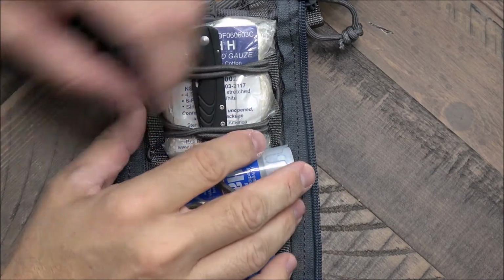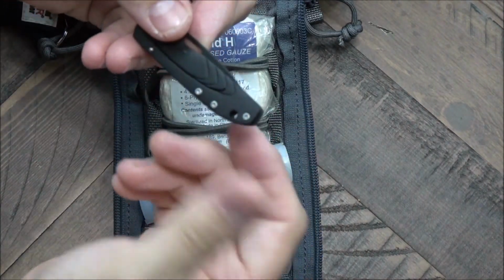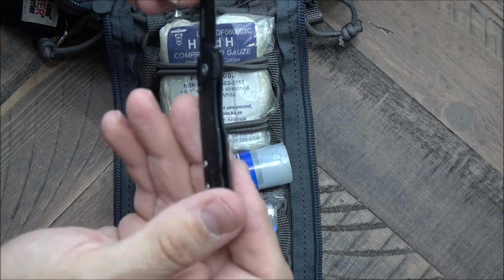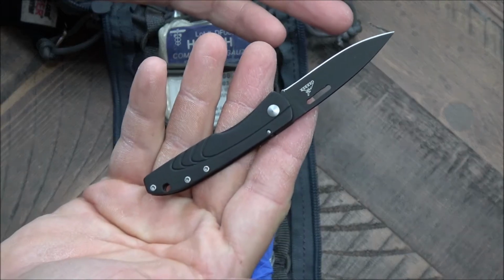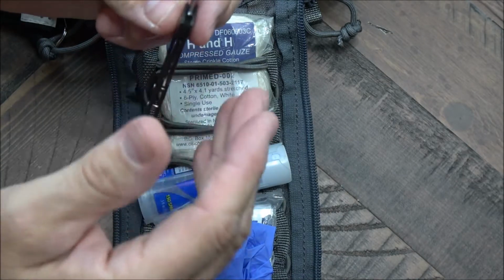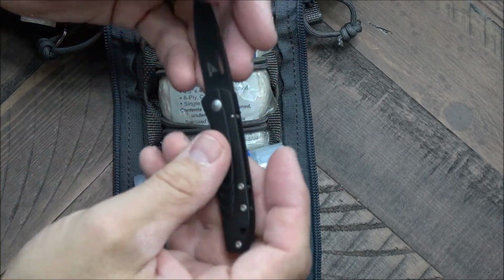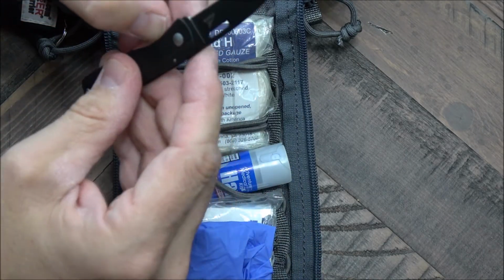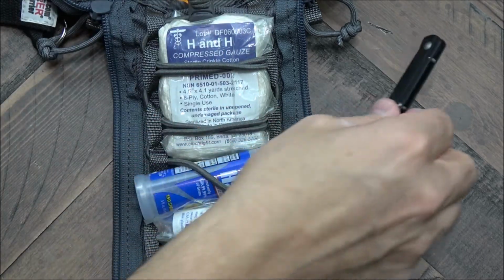Alright, so up top you'll notice that I've got a small blade. I like to keep a small knife in all of my medical kits. You just never know when you're going to need something sharp. And this can actually double as an emergency trauma shear if I need to. Maybe for whatever reason I've lost my shears or they're being used by somebody else, I've just got a small little knife. It's very sharp, that I could use in that particular situation. So I keep those in my kit.